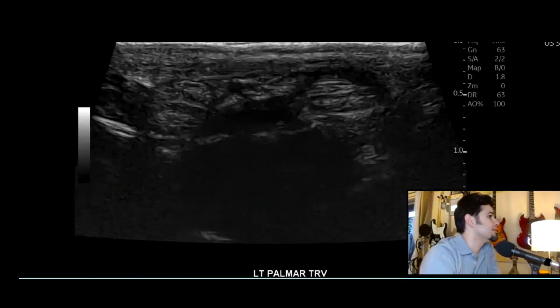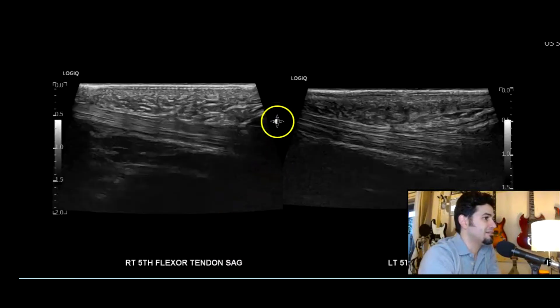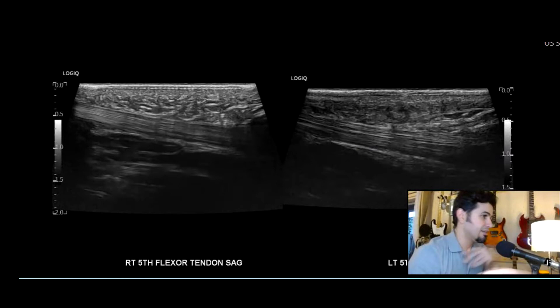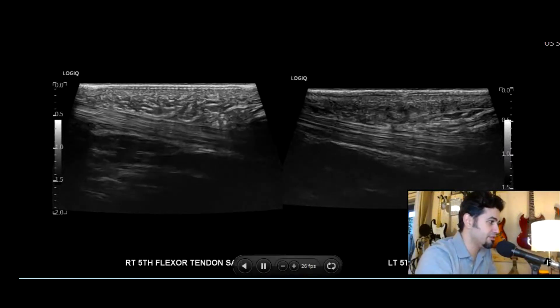Let's look at the clips. Here's a clip side by side of the flexor tendons on both hands of the fifth digits. You can see the motion — they're pretty intact, no injury there.